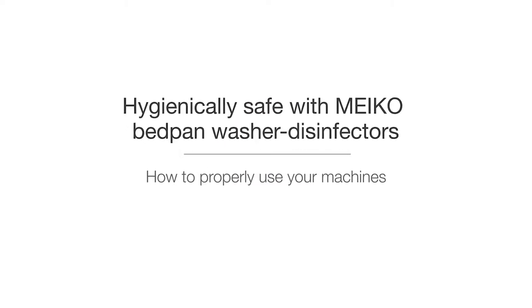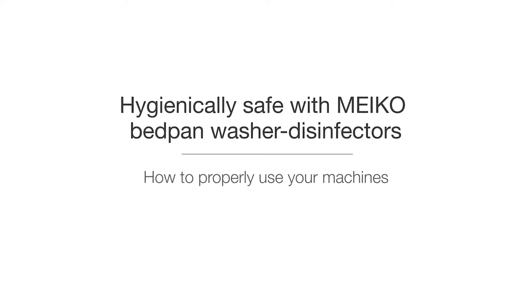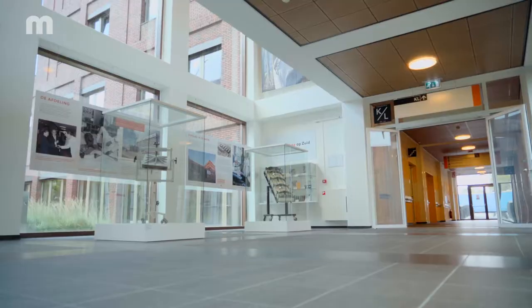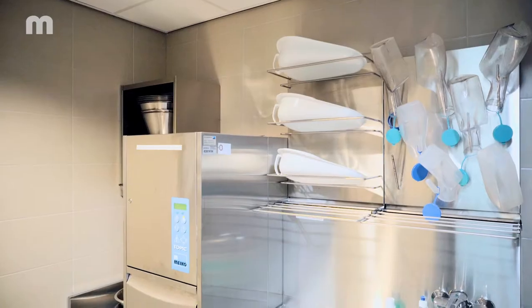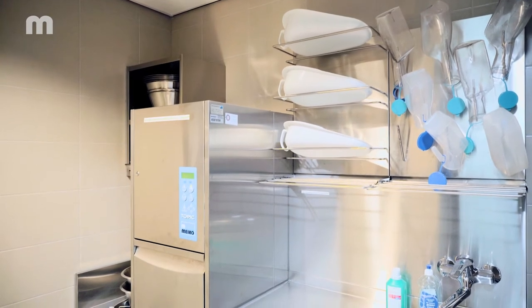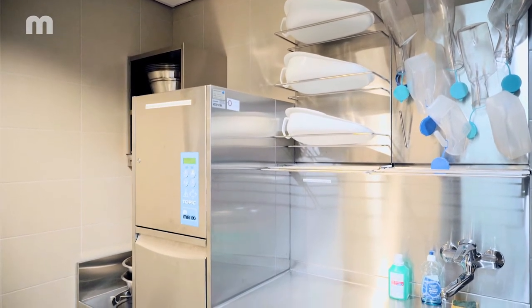You work with a bedpan washer disinfector from MEIKO with manual door opening? In this video, we want to show you how to operate the appliance correctly. While doing so, always make sure to observe hygiene and clothing regulations that apply in your workplace.